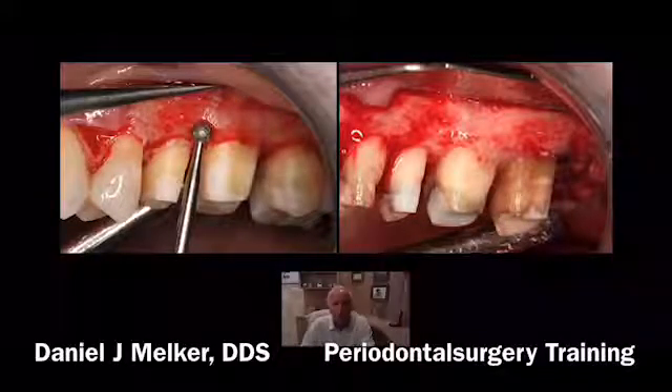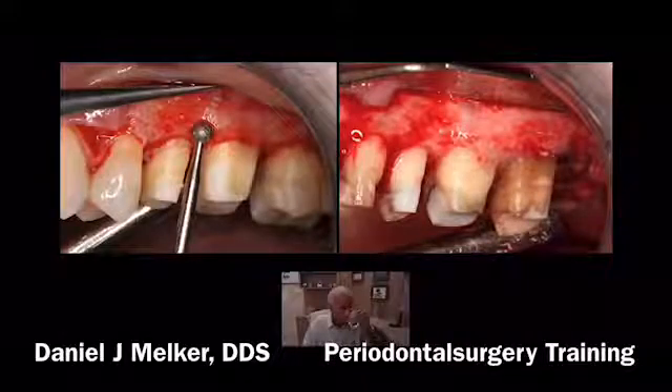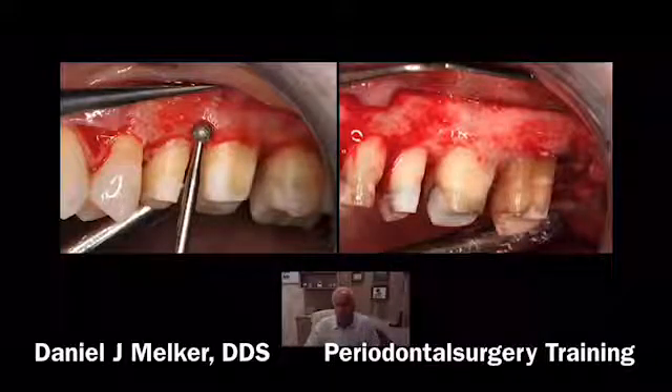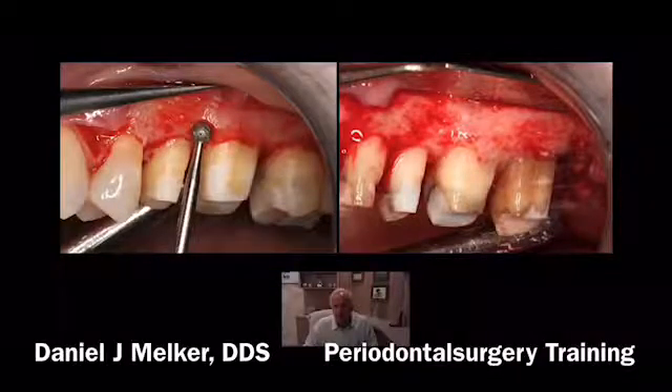I like to use a diamond round burr — a number six diamond round burr. If you've been doing osseous surgery for 10, 15, or 20 years you could use a carbide burr, but when you first start out, a carbide burr is way too aggressive and you can really destroy the bone with it. My recommendation is to use diamond burrs. Carbide burrs can really ditch the bone, and if you have a large marrow space and you hit it, you can take a carbide burr right through to the marrow space and hit the root.